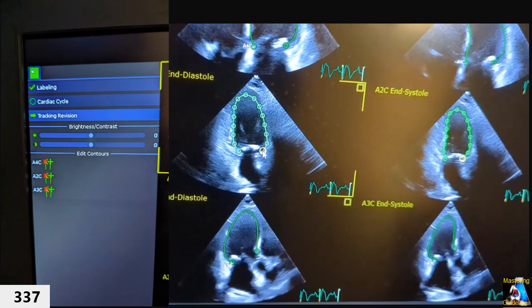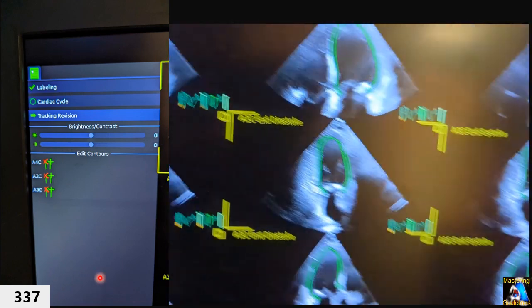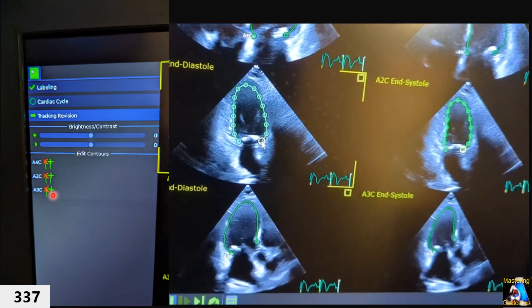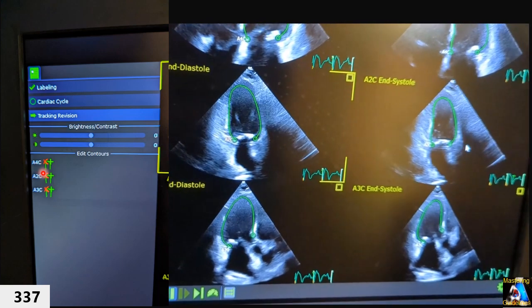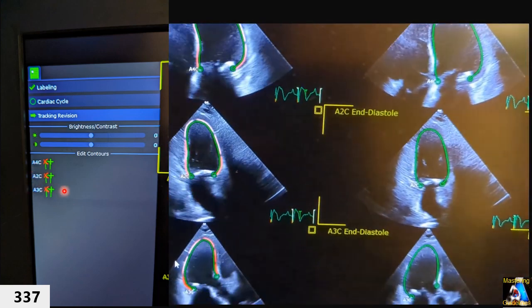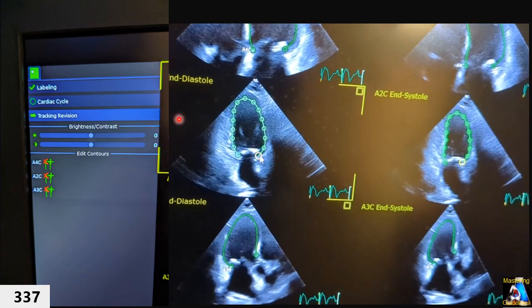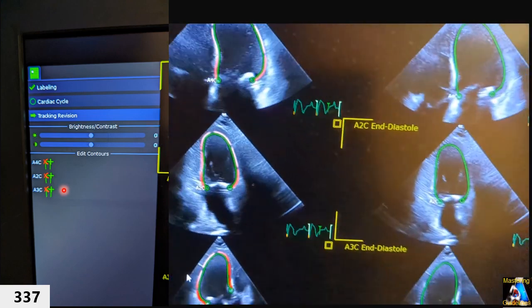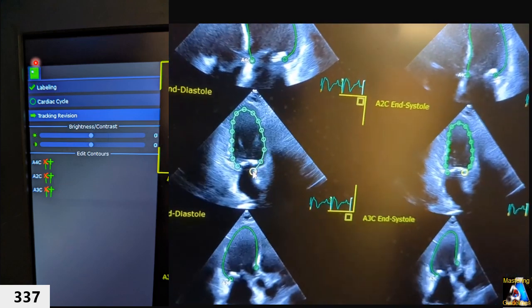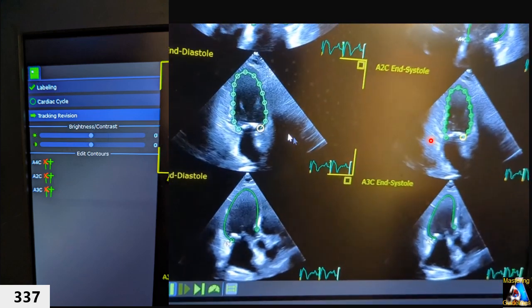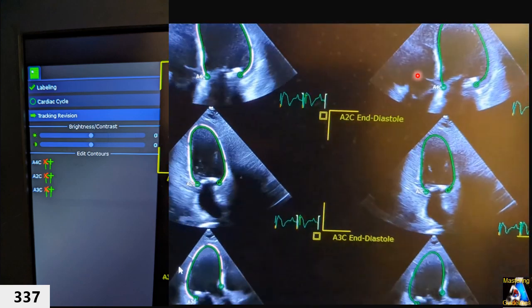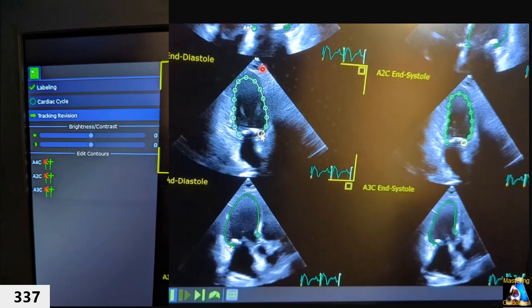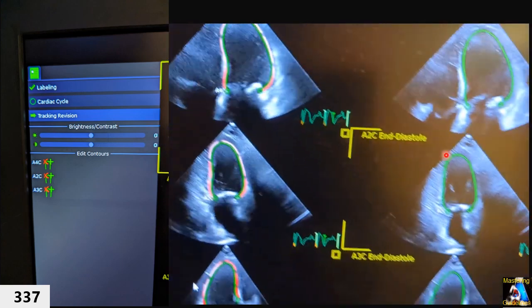If other views also have tracing errors, apply the same correction to apical two and apical three as needed. If the overall trace looks acceptable but specific segments are slightly off during diastole or systole, click the checkbox to display the diastole and systole frames separately for each view, allowing targeted adjustment.